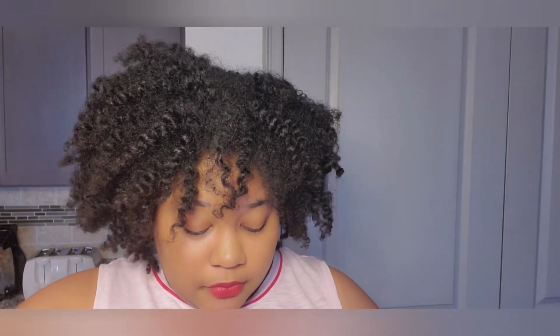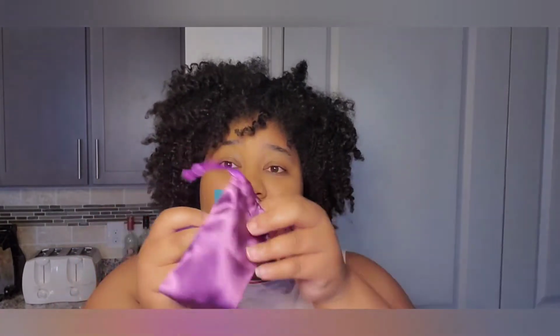I've read soap and water is the best thing to clean it. So be mindful if you're trying to change in public. Always have something to store it in. So let's say I leave the house in the morning and I'm wearing this one. I use the carrying case to carry my clean one. And I'm assuming that I would have a plastic bag in my purse to store the soiled one. I don't know how I feel about changing this in public, even washing it with soap and water in a sink outside of me being home. I don't know how I feel about that personally, but I'm not judging those who do.